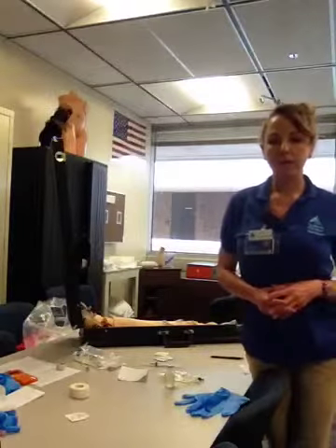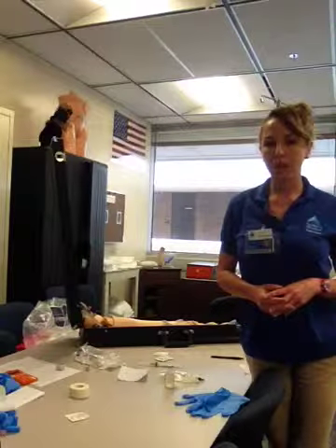I'm Katie Branning, and I'll be demonstrating medication administration via minibag.